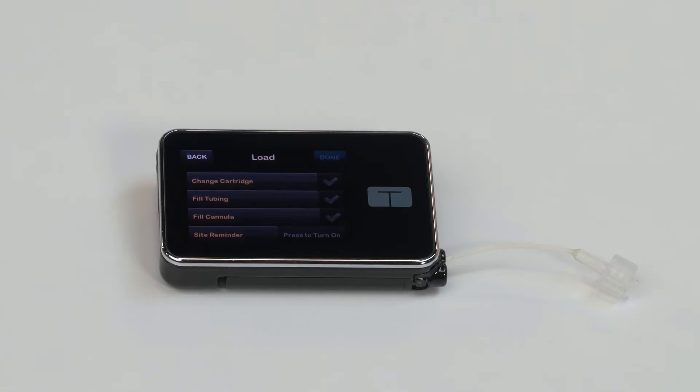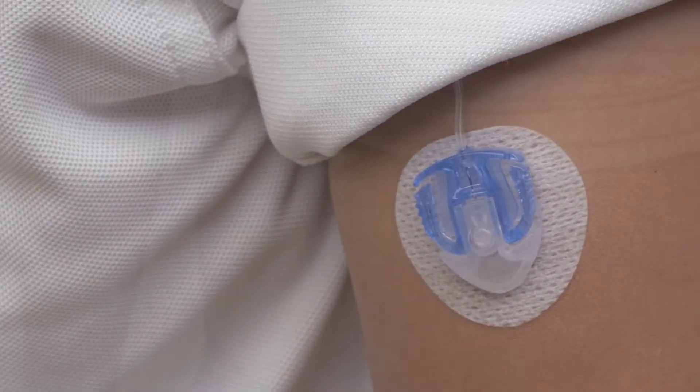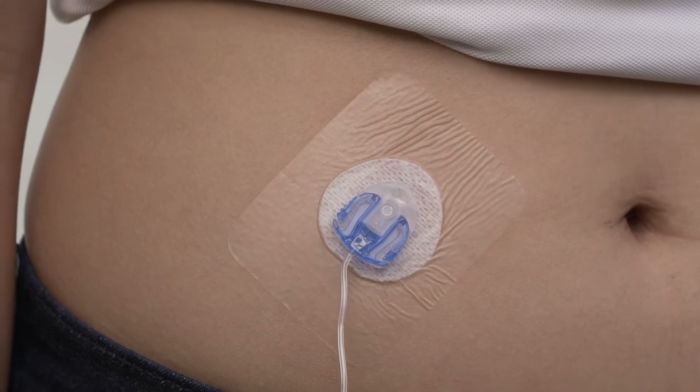In this video, we're going to cover the different infusion sets available for Tandem's family of insulin pumps and talk about some of the differences between them. The infusion set gets its name because it's where the insulin from your pump is actually infused into your body.